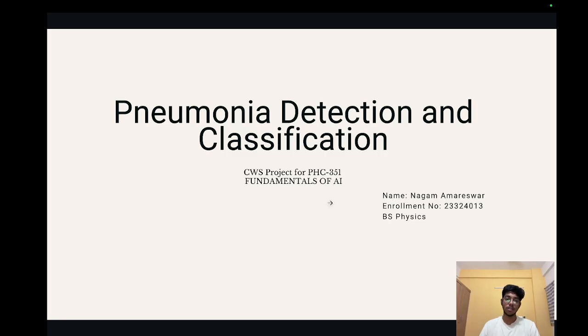In this video, I'll be presenting my CWS project for the course Fundamentals of AI. The name of my project is Pneumonia Detection and Classification.